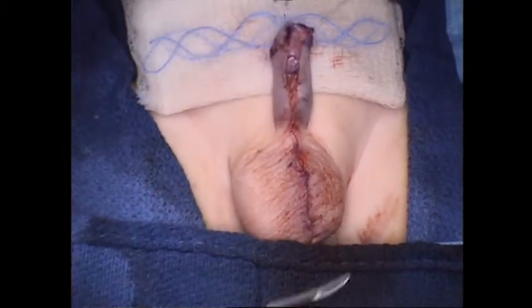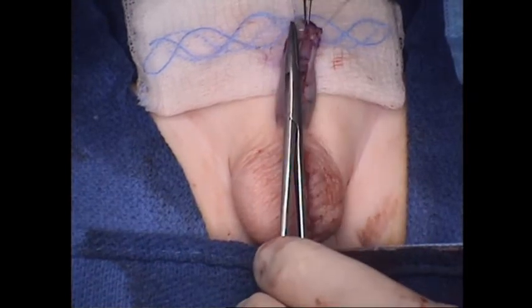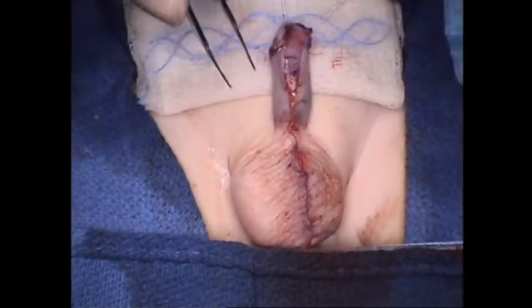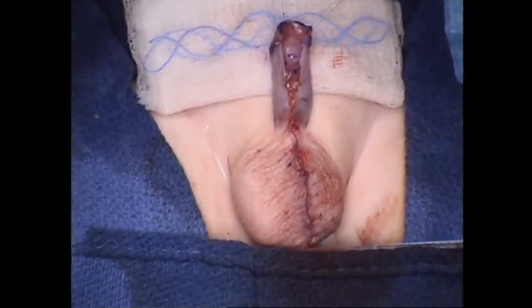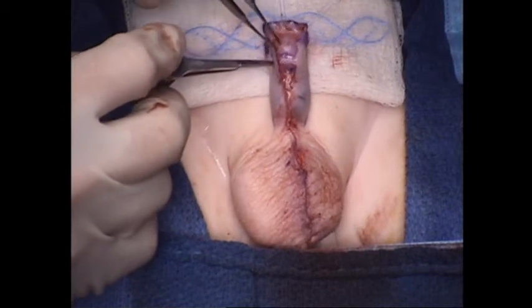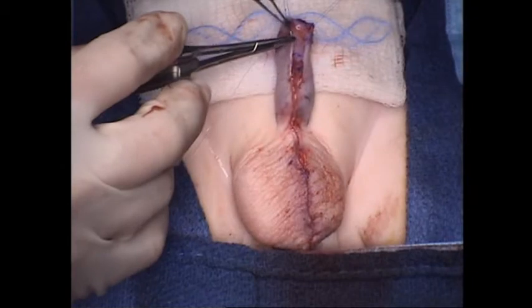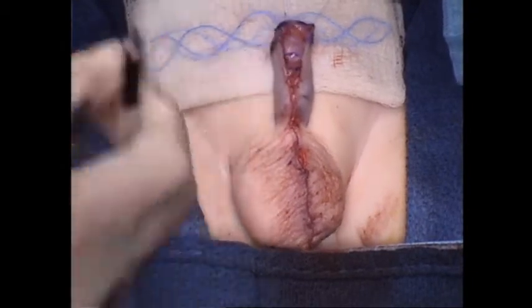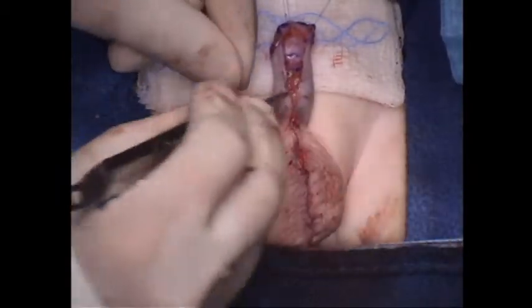She's cutting away some extra skin. Again, emphasizing that there is enough skin if we're having to cut some of it away. And since we had a little extra on this corner here, I'm going to go ahead and take this up to secure it to the mucosal collar here. This is such a crucial area where you don't want to have foreshortened penile skin at the second stage.